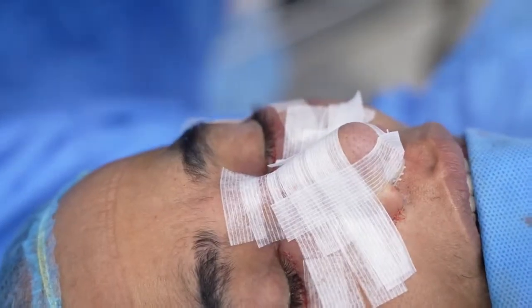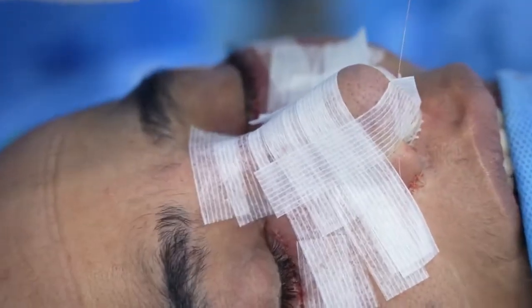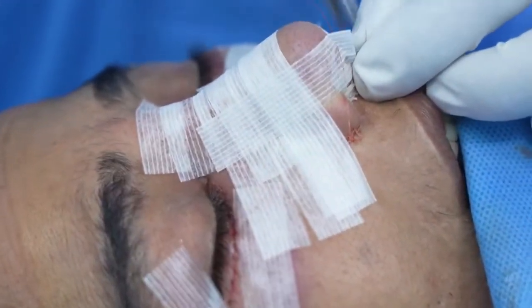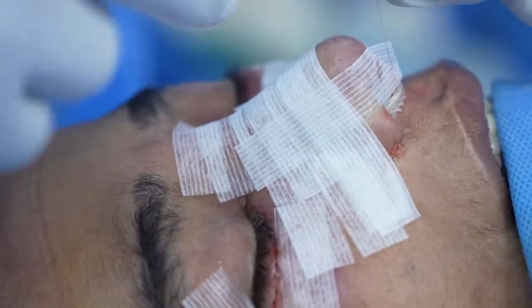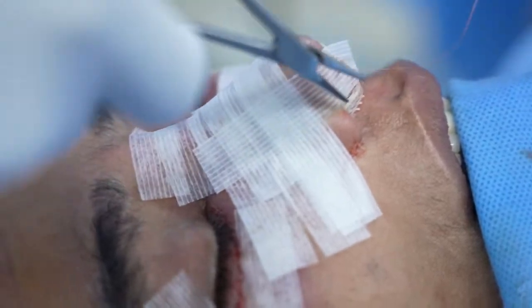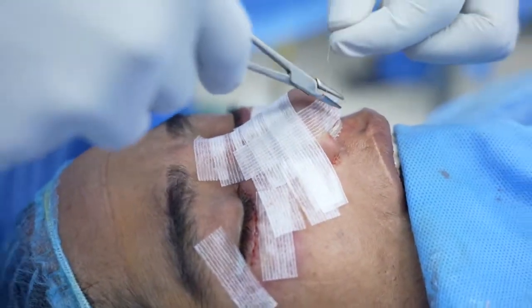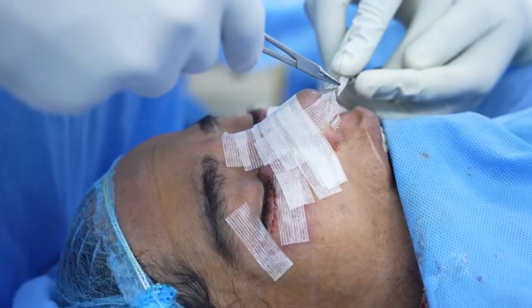And then I'm going to put a stitch here. So this is to make sure the steri strip stays in place. These are pretty much standard techniques for all patients. Some variations can be there, but usually I do these for almost all patients that undergo rhinoplasty.